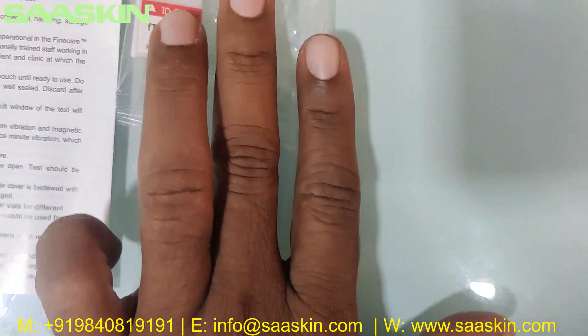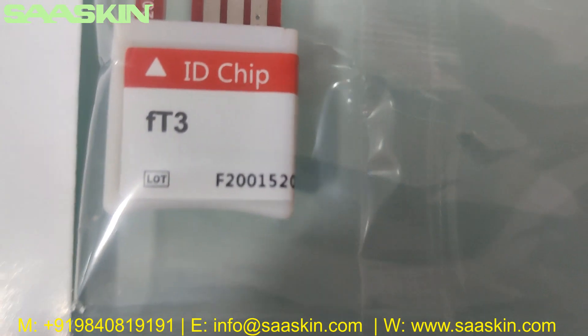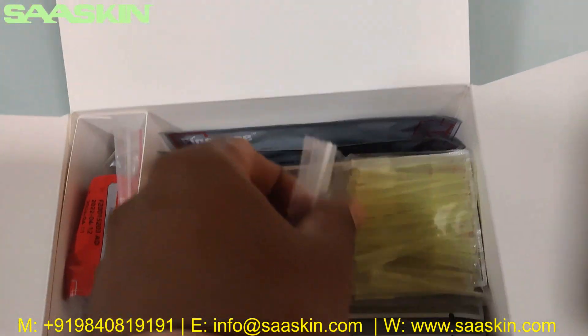Inside you can see there is one chip. This chip has the test and test calibration information, along with the lot number. And then you have 25 paper tips.